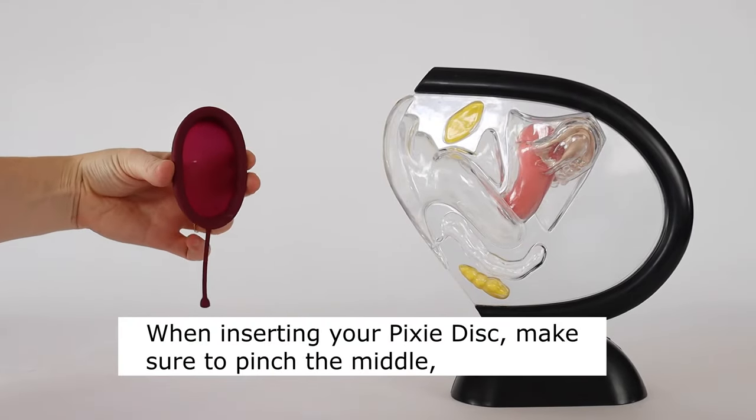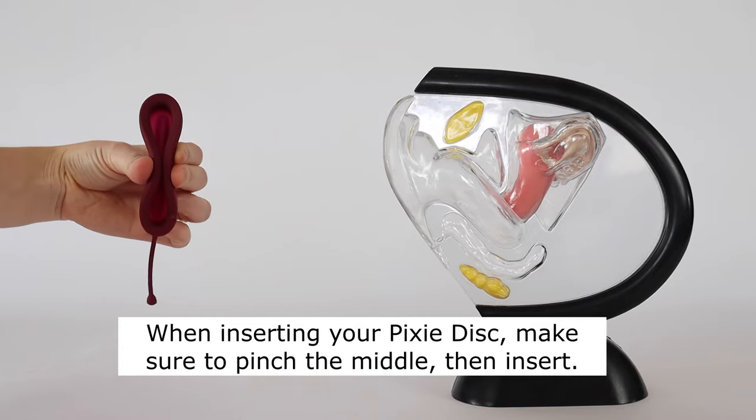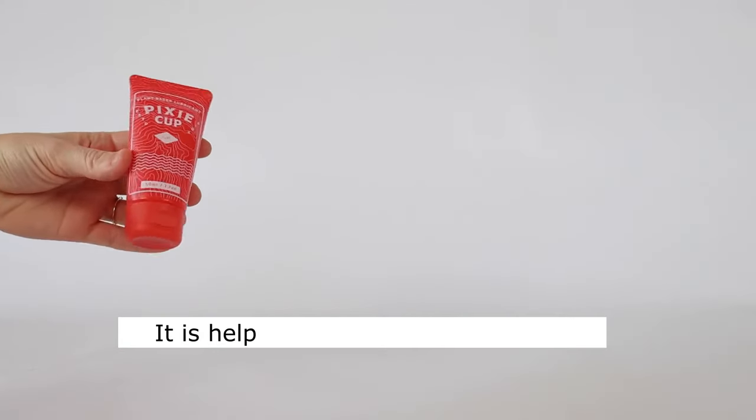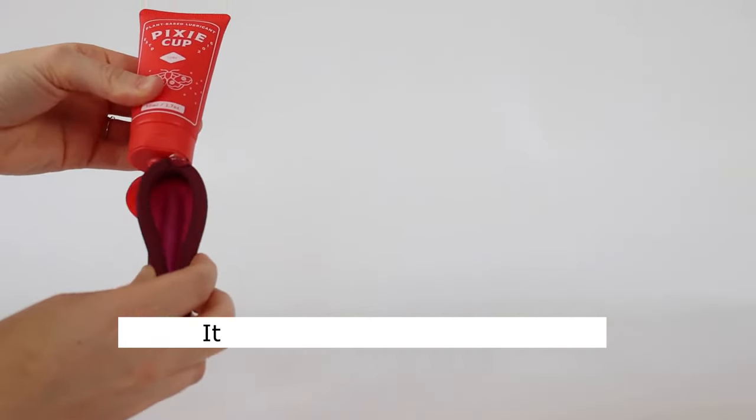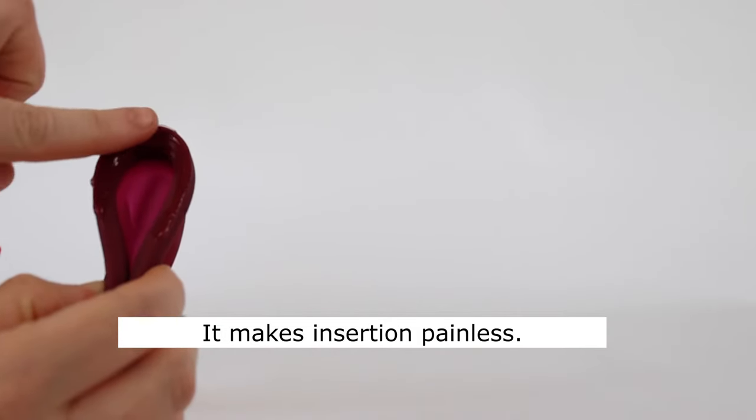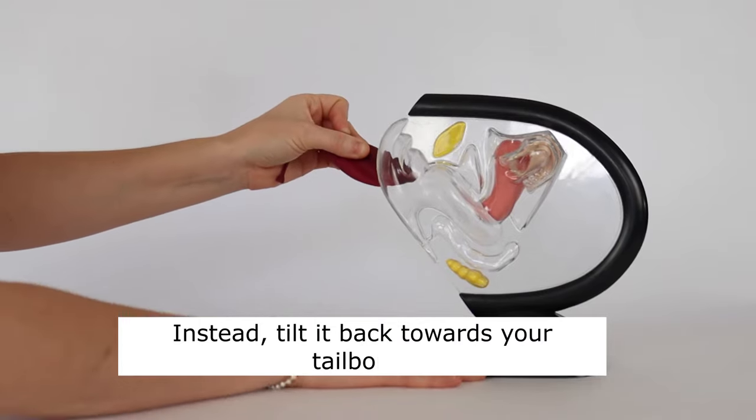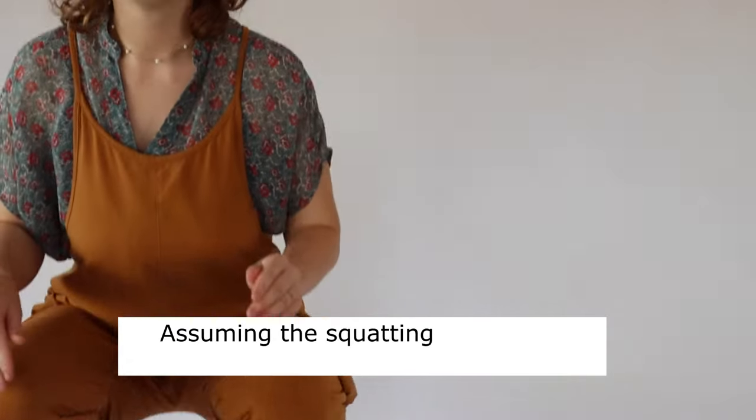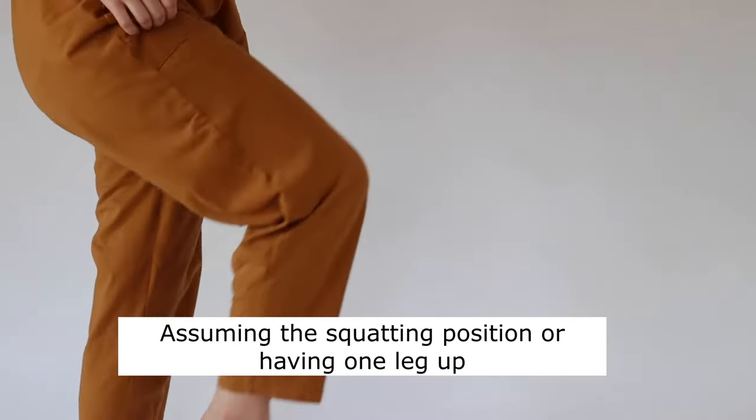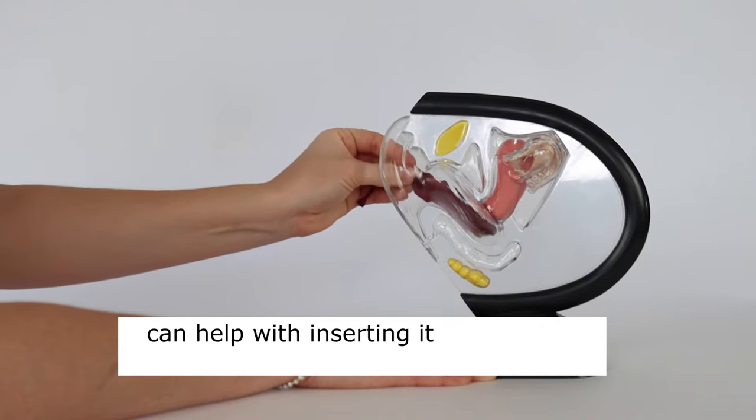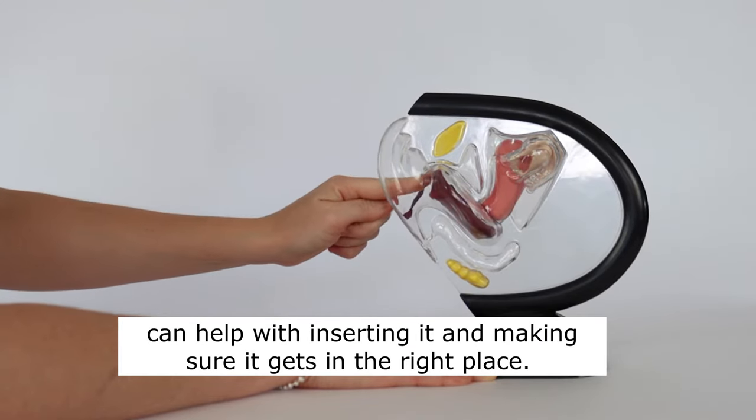When inserting your Pixie disc make sure to pinch the middle of the disc and then insert. It is helpful to use some Pixie Lube. This does make for a painless insertion. Now you don't want to insert it straight back. Instead tilt it downwards towards your tailbone. Assuming the squatting position or having one leg up can help with inserting it and making sure it gets in the right place.